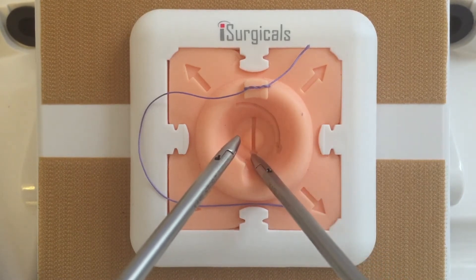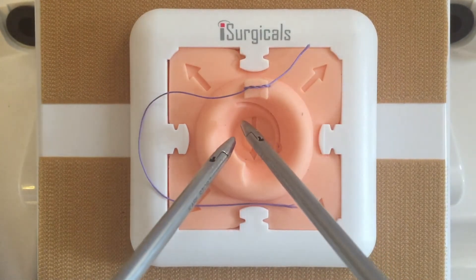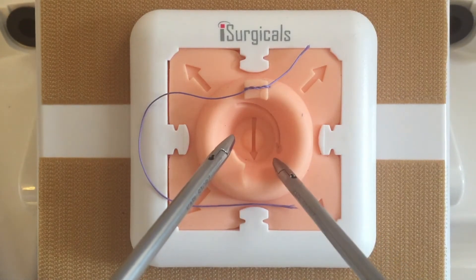The central straight arrow guides needle holder movement for the C technique, and the curved arrow for the D technique.